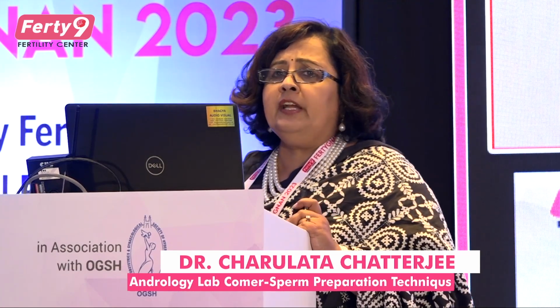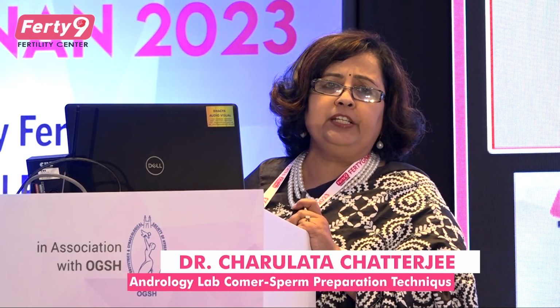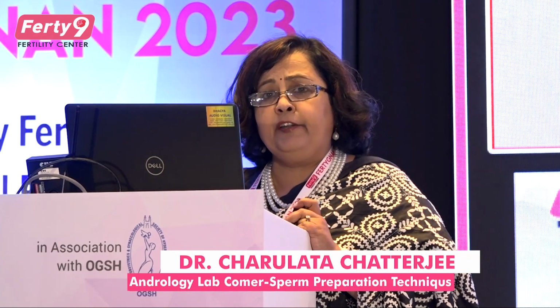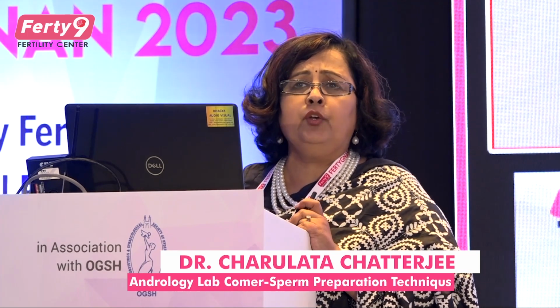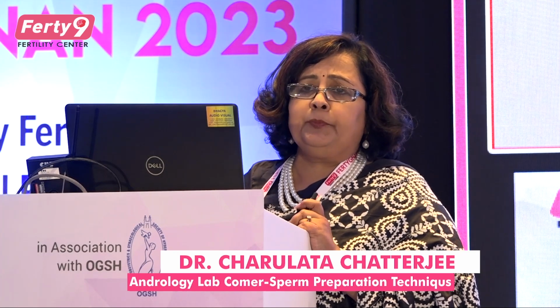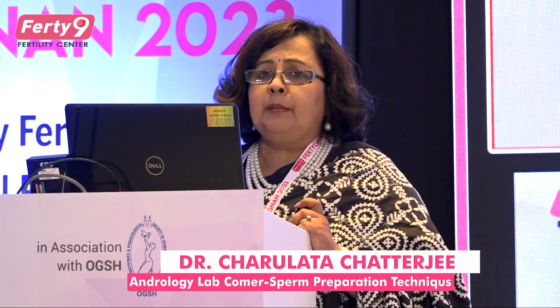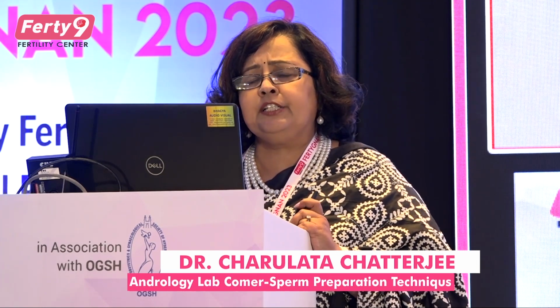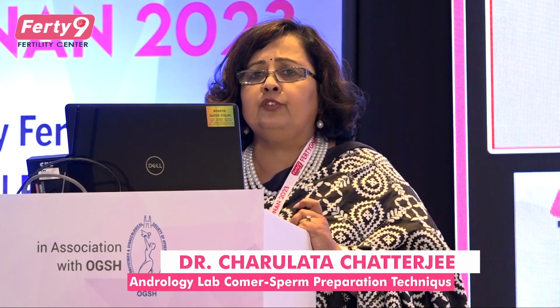Now what we have discussed is the basic sperm preparation technique. There are many basic preparation techniques, but there are also advanced sperm preparation techniques which are included in ART. So what does advanced mean? The basic procedure gives a good yield, but sometimes nowadays, because of lifestyle or many other factors, sperm DNA is getting fragmented. When the sperm DNA is fragmented, it hampers fertilization and implantation. Even if it is implanted, the lady might end up with a miscarriage.